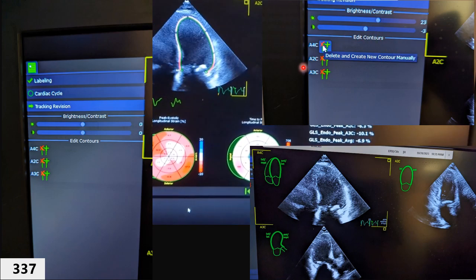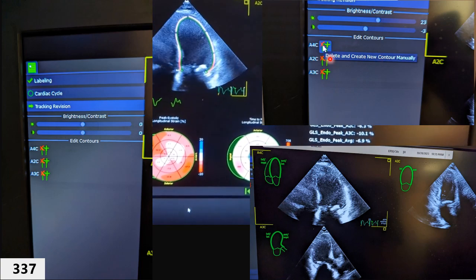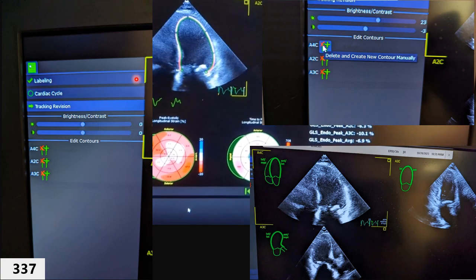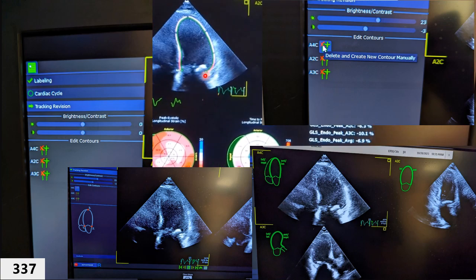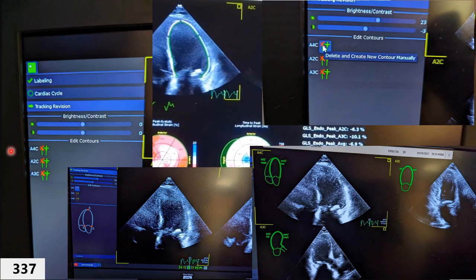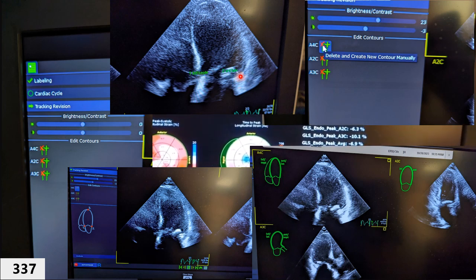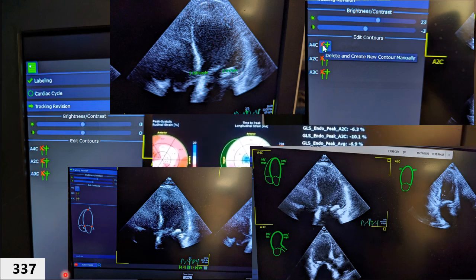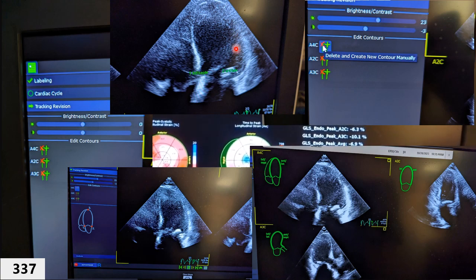Under 'Edit Contours,' you will see options for apical four, two, and three. Move the trackball to highlight the view you want to correct, for example apical four, then press Select to delete its tracing. The machine then prompts you to manually mark three points: first move the trackball to the medial annulus and press Select, then move to the lateral annulus and press Select, and finally move to the apex and press Select. After marking those three points, press Analyze and the machine will re-trace the endocardium through the cardiac cycle.